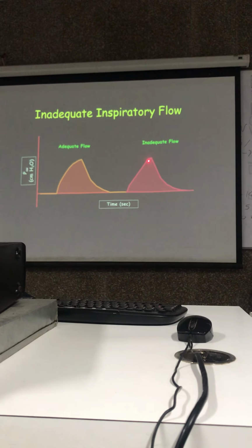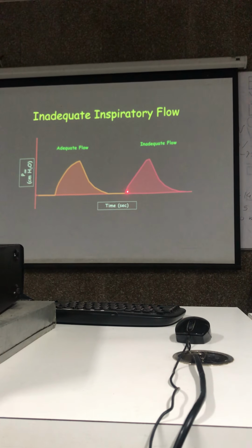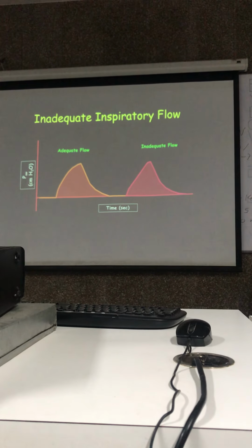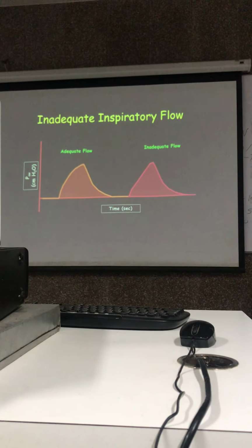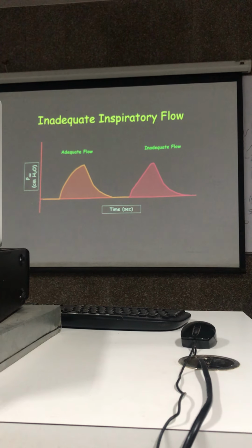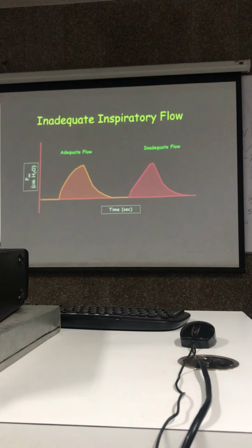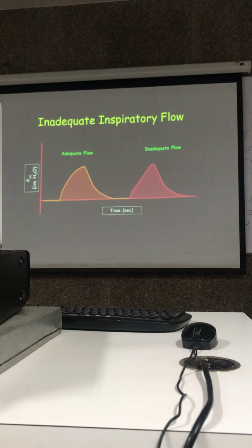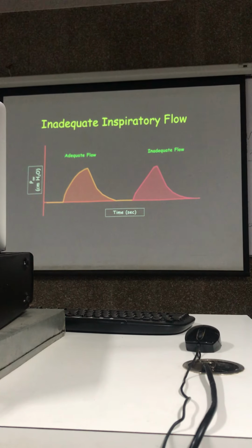This is straight. Okay? So when you see a pressure time scalar where you have a straightened inspiratory limb, it tells you that this patient has got inadequate flow. So you may need to increase the flow, and it's not uncommon when you see the Puritan Bennett ventilator which we have, and you try it on a patient, keep the flow at 30, he might need 40, 50. So often we used to get a concavity. When it is more, if it is terrible, I think the patient's efforts are much more.